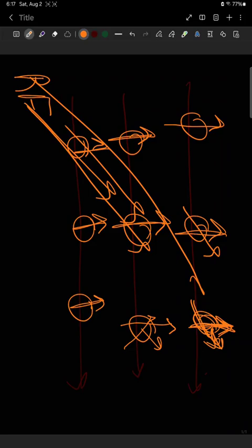So the MRI machine detects those tiny signals and we build images from them, because as they relax back into alignment, they emit signals. When they got affected by the RF frequency, they go back and relax into the alignment.